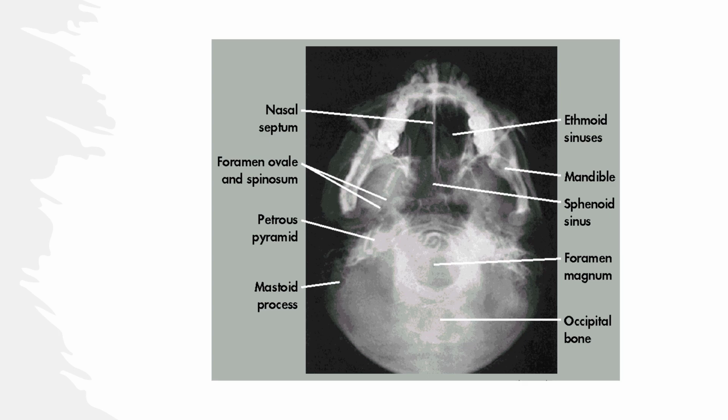Just look at the center of this radiograph. You see the mandible. You can see the mandible, can't you? Yeah, there's the mandible. It's indicated for you. You can definitely see the teeth of the patient coming off of the mandible. Well, that indicator on the right-hand side, that's actually the coronoid process of the mandible.